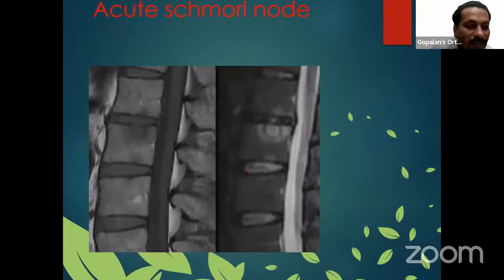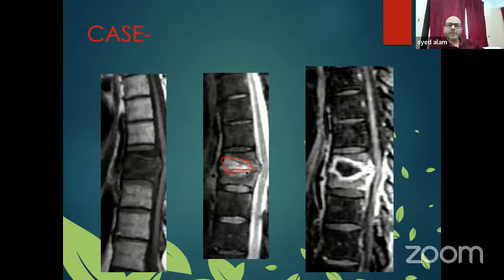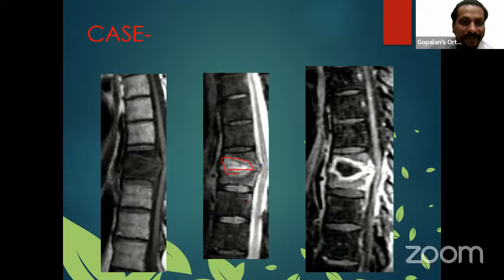Syed, if I can interpret for a second. Sure. Yeah. So how do you differentiate it from a malignancy? That is the most common differential. Again, very good question. In malignancy, normally the disc will be normal. In TB infection, the disc will be slightly abnormal. In malignancy, the disc will be normal. So if the disc is normal, think of the bad thing. So that's a very good sign basically. So if the disc is destroyed, it means we are safe. Yes, correct.